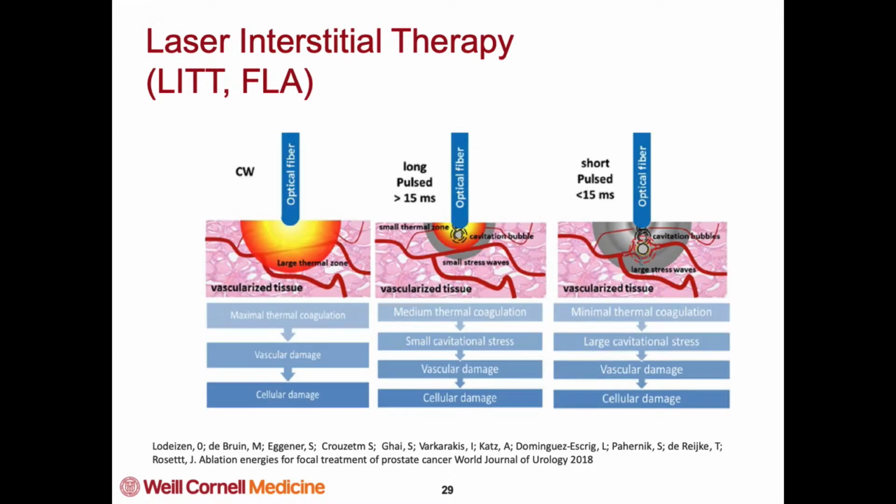Laser is another interest, particularly FLA. This has generally all been in-bore in the MR machine. There's a couple studies that have looked at out-of-bore ultrasound-guided FLA. The problem with this is that there's really no way to monitor the ablation at all that way. And if you look at the studies that look at FLA out-of-bore, the positive rate in the ablation zone approaches 80%. So you're not doing much with regards to treating. It's probably better done in the magnet.